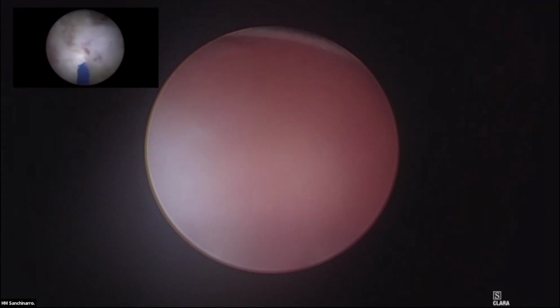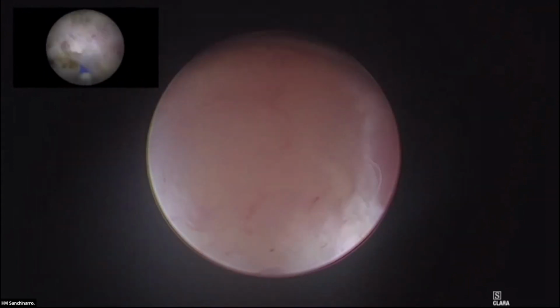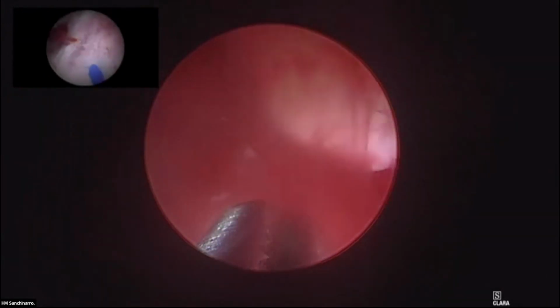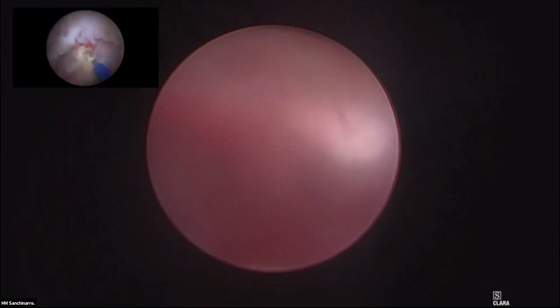You have the last piece of adenoma inside the fossa, isn't it? Giorgio? Yeah, I'm morcellating now. I have the bladder that is a little bit empty, so I need to fill it up. But see, just these little pieces.